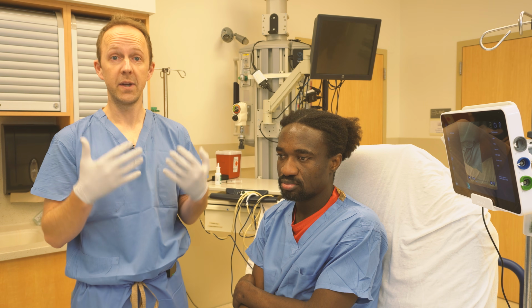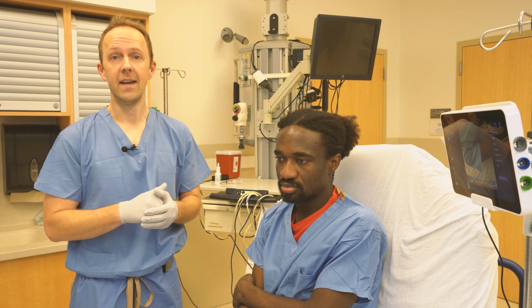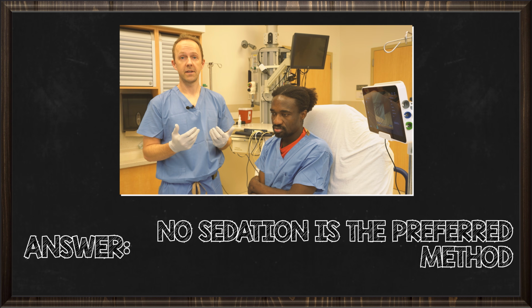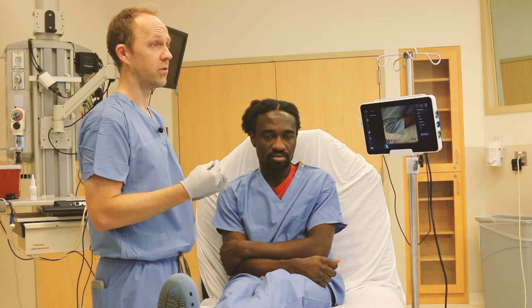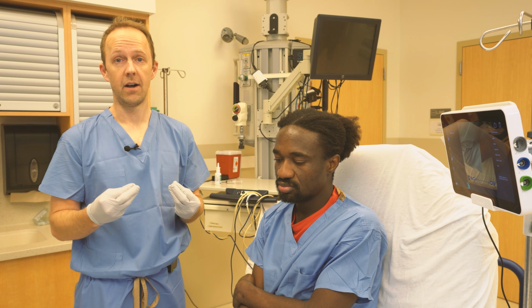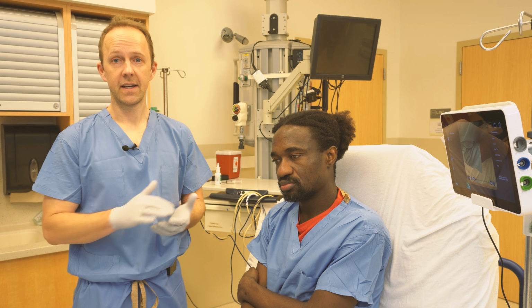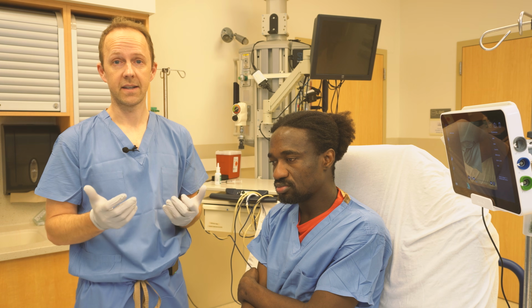So the reason we're doing this is because we want the patient to protect their airway as much as possible and follow commands. So we prefer to use no sedation if possible. That's why we're going to be doing such a meticulous job at topical anesthesia. I think it's really important to coach your patient through this procedure so that they know what's coming and aren't surprised by anything. And the goal is to use no sedation at all. If you're going to use a sedative, use midazolam as anxiolysis, because that allows the patient to still follow commands and just be a little relaxed.